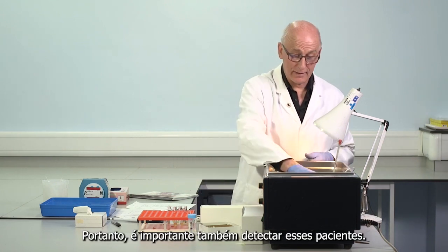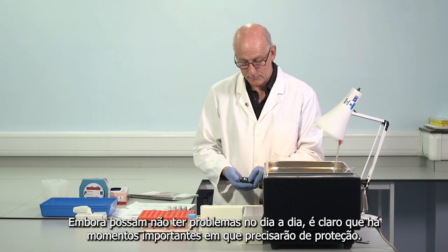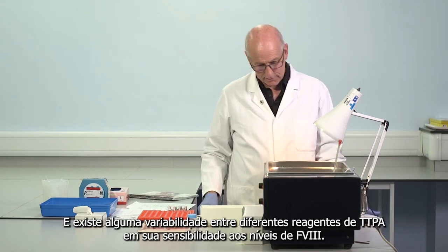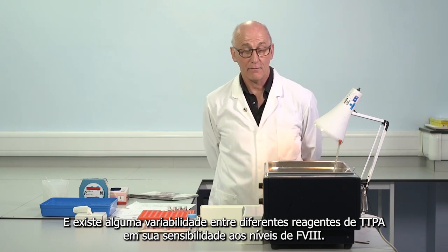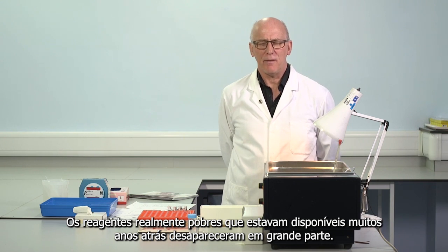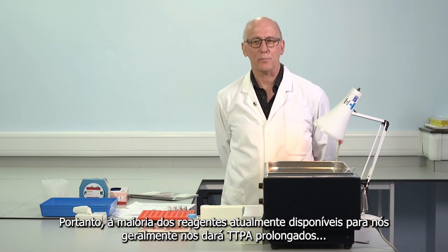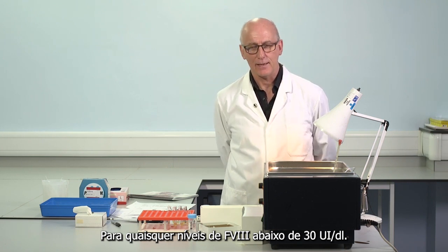So it's important also to detect these patients. Whilst they may not have day-to-day problems, of course there are important times where they're going to need protection, so we want to know about these levels. And there is some variability between different APTT reagents in their sensitivity to the levels of factor VIII. The really poor reagents that were available many, many years ago have largely disappeared, so the majority of reagents currently available to us will usually give us prolonged APTTs for any levels of factor VIII below 30.